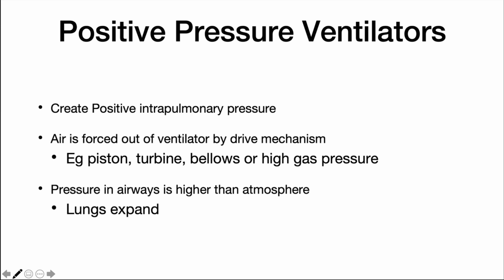Positive pressure ventilators first began to appear in the 1950s. From that time until today, they have undergone many changes, but can be distinguished by the type of controlling mechanism used in their drive systems. And this can be seen in three distinct generational changes. The first generation of positive pressure ventilators were characterized by pneumatically controlled drive mechanisms. Additionally, these devices used pneumatic timers and regulators to apply pressure to the lungs.